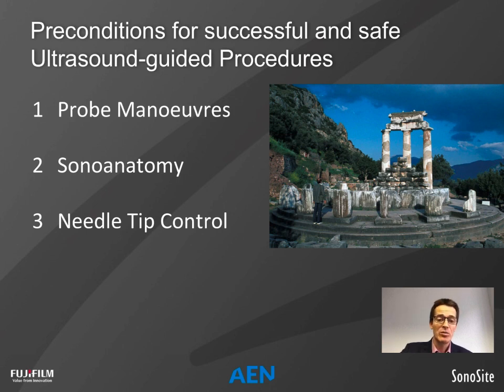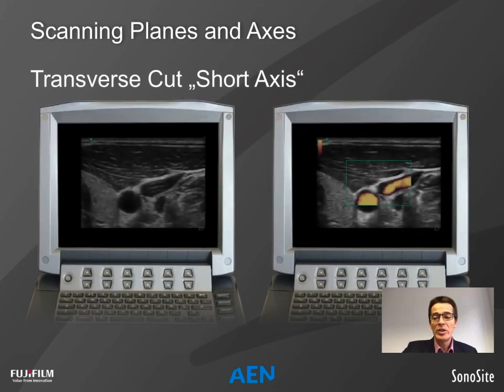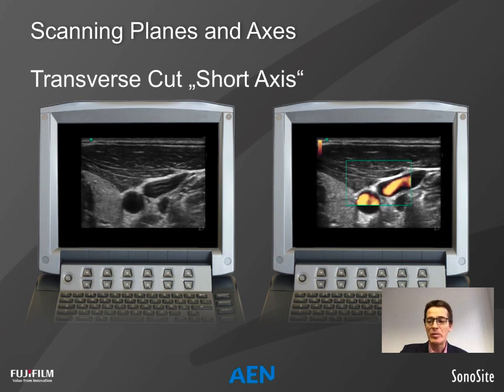And the second pillar is sonoanatomy. So we need to have a deep knowledge of what we are looking at. And the third thing, and this is going to be the major thing we are talking about today, this is needle tip control. To start with, we go over some basic information so that we know what we're talking about within the rest of this webinar.